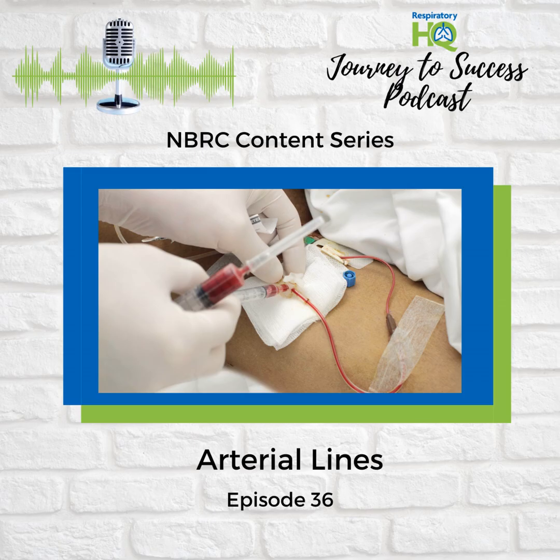Connected to a monitor that shows the pressure changes. It's a really thin tube, so it's not as scary as it sounds. So why would someone need direct access to their artery? There are a couple reasons. Like if someone needs their blood pressure monitored constantly, like during surgery. Yeah, exactly.